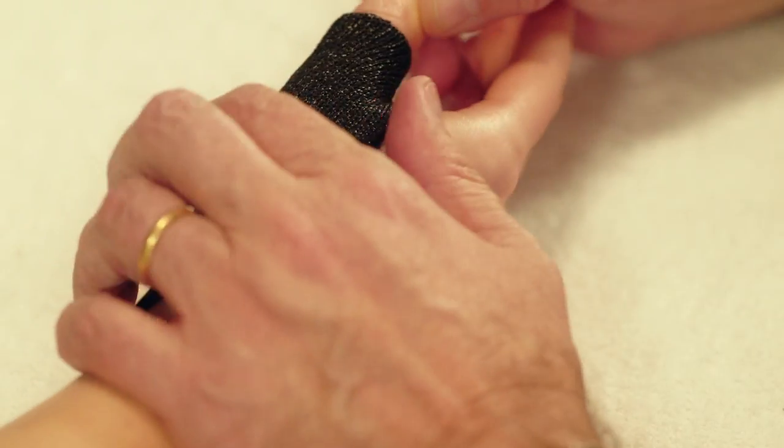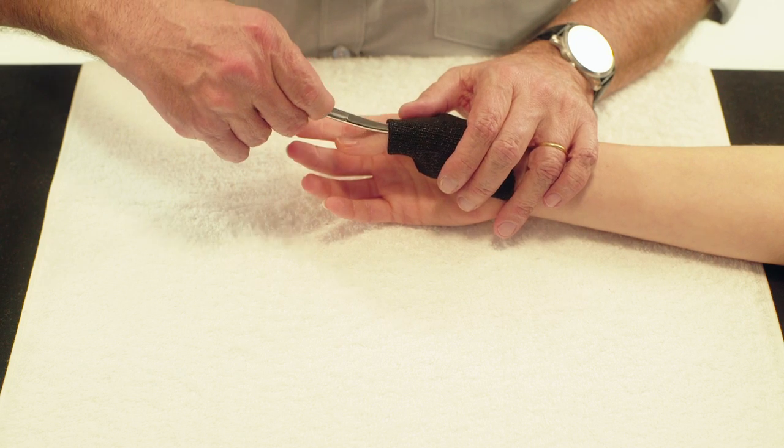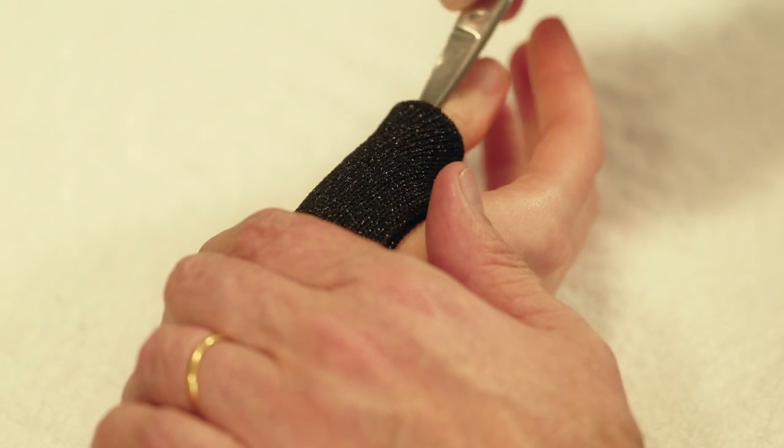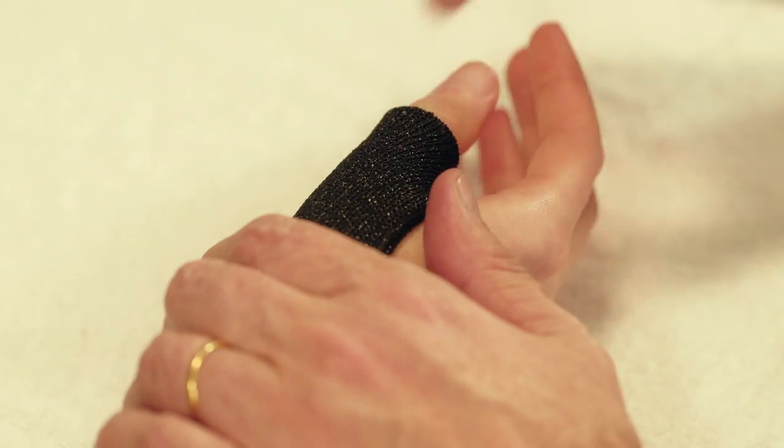Position the thumb in opposition. Use curved scissors to broaden the thumb space in order to make removal of the orthosis easier.